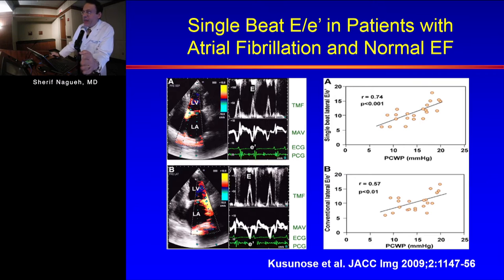The one event that is not delayed in the setting of this ventricle is the change in the cross-sectional area, or the changes in circumferential strain in early diastole as well. So a diseased heart gets delayed longitudinal expansion. And the driving factor for the flow across the mitral valve is the higher LA pressure, not the drop in the LV pressure, albeit LV pressure is still dropping.